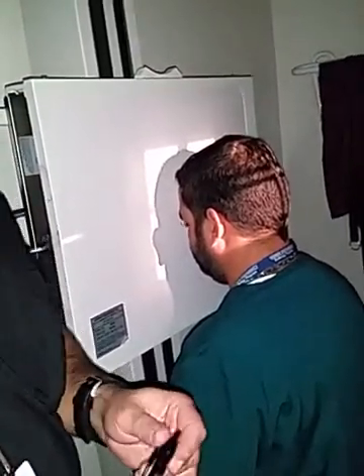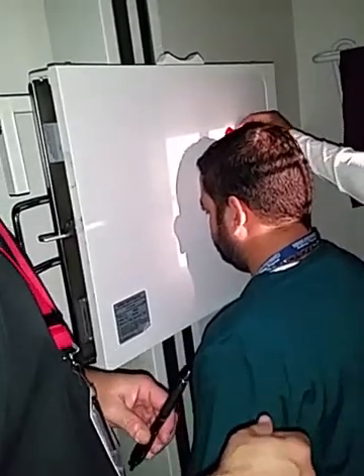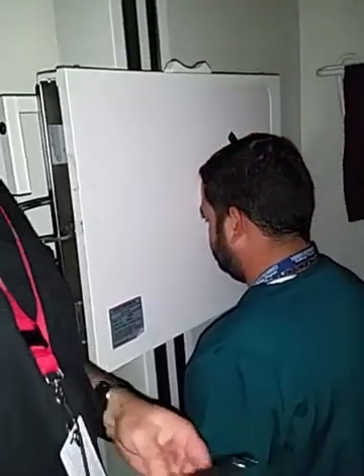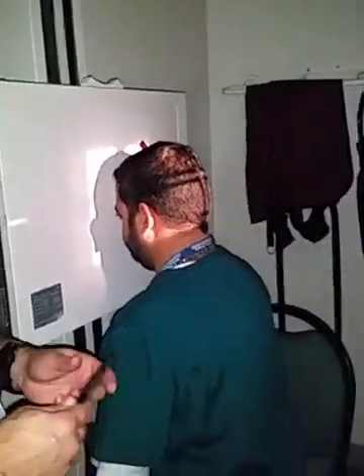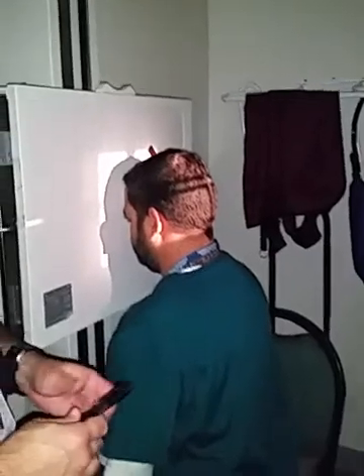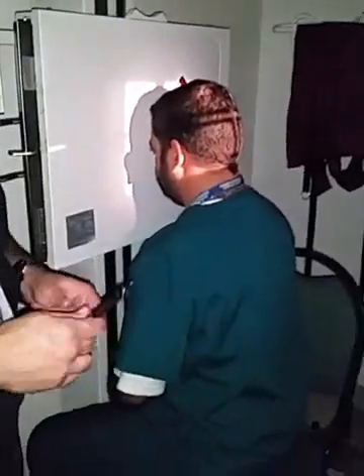I have another question though. For someone like me, if I'm the patient, do I take off my glasses, or is it okay to leave them? No, you have to take off your glasses. Even if it was plastic and not metal or anything? I'd still take off your glasses.